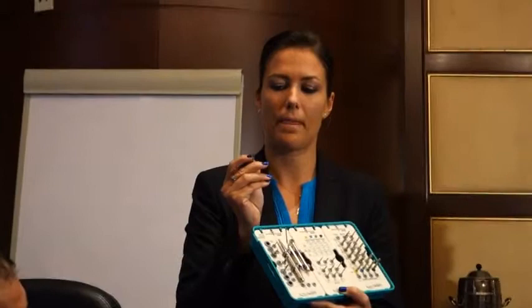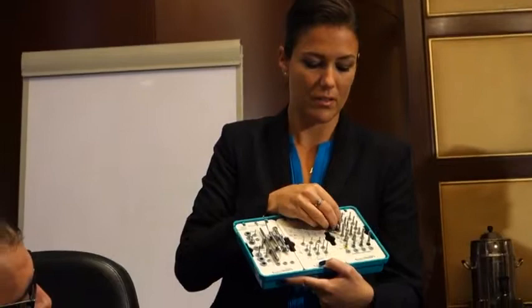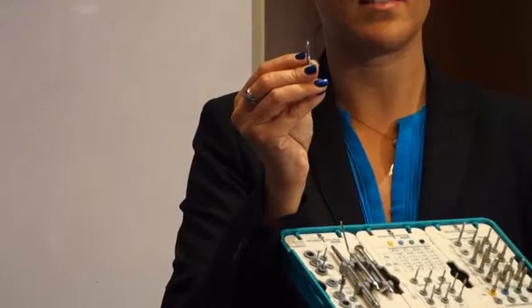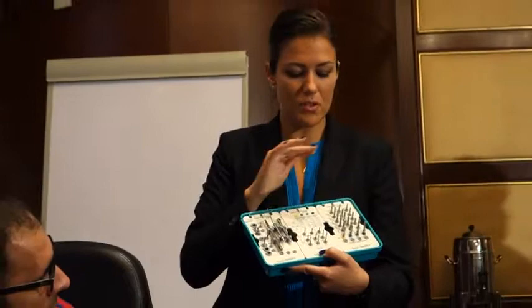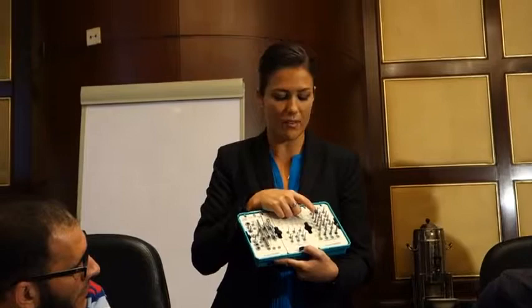Drill number 4 works the same way — first line for length 8, second line for length 10, so drill down to the second line. After step 4, try placing your implant. If it doesn't fully seat, you can use drill number 5 as indicated in the protocol, depending on whether the implant can be fully placed or not.